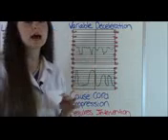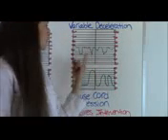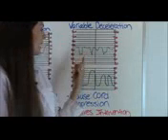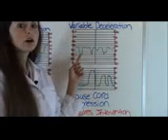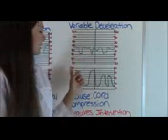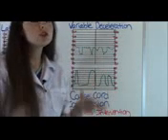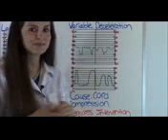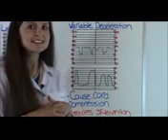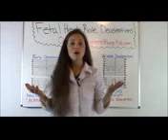Again, this can happen at any time. It doesn't necessarily mean mom's contracting and that's when you're going to see a response in the baby's heart rate. For instance, look, mom's having a contraction right here and the heart rate really isn't doing anything, and then after the contraction it's moving. It comes and it goes. So it's not uniform like our late and early deceleration. So that's something you really need to remember. So that was that. Okay, so we went over fetal heart rate decelerations.